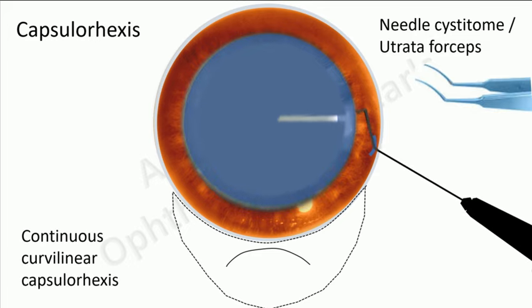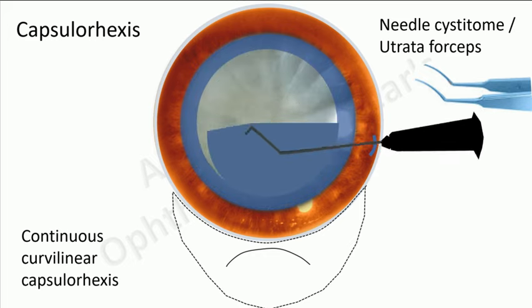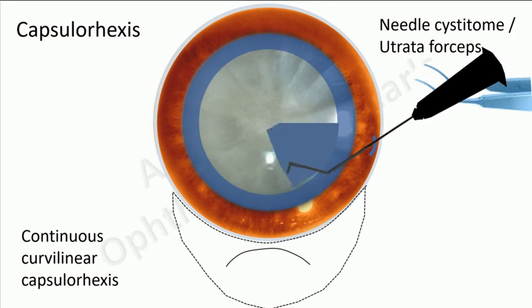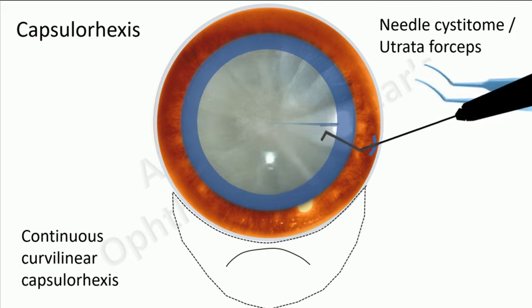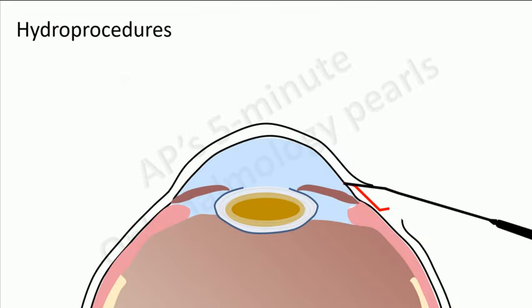A continuous curvilinear capsulorhexis is the preferred method of capsulotomy. A bent 26 gauge needle can be used, in which case it is referred to as a needle cystitome. Alternately, an Utrata forceps may be used. Now the anterior chamber is entered with a keratome. This is the third plane of the triplanar incision and the incision is extended on either side to complete the internal opening of the tunnel.